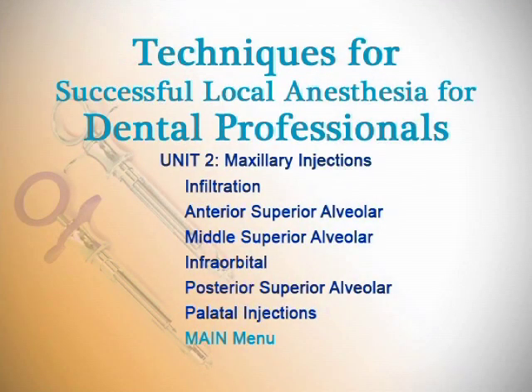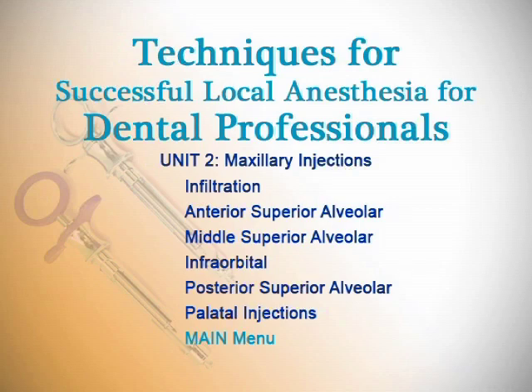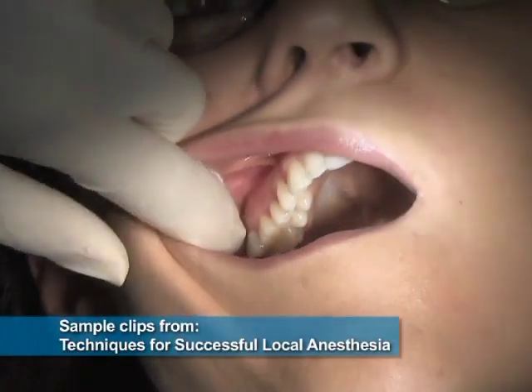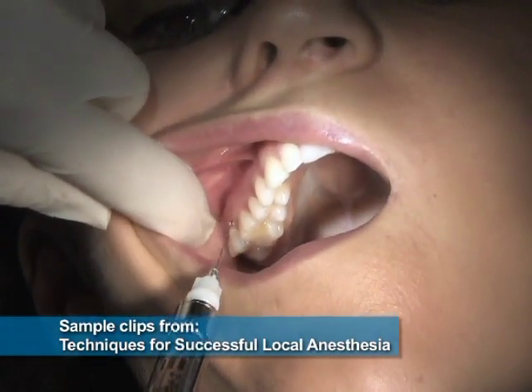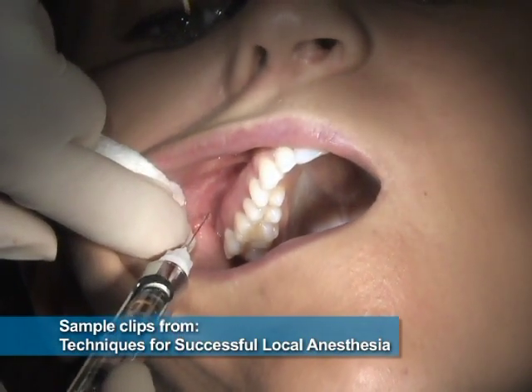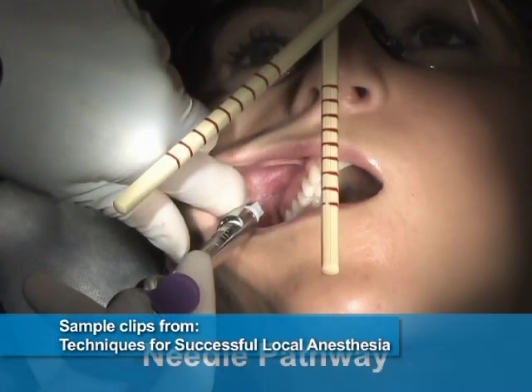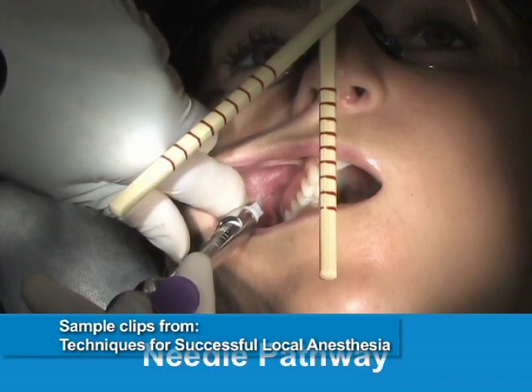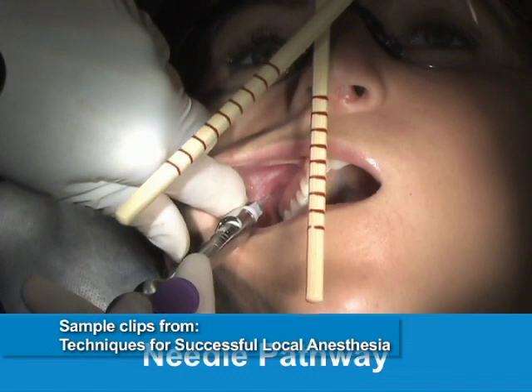It is further divided into maxillary and palatal injections. Unit 2: The posterior superior alveolar, or PSA, is a nerve block injection that anesthetizes the pulpal and osseous tissues, periodontal ligaments, buccal gingiva, and adjacent vestibular mucosa of the first, second, and third maxillary molars. The pathway of the needle is at a 45-degree angle to the occlusal plane and 45-degree angle to the mid-sagittal plane of the maxillary molars.